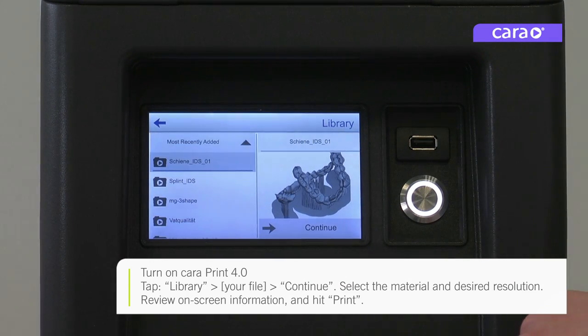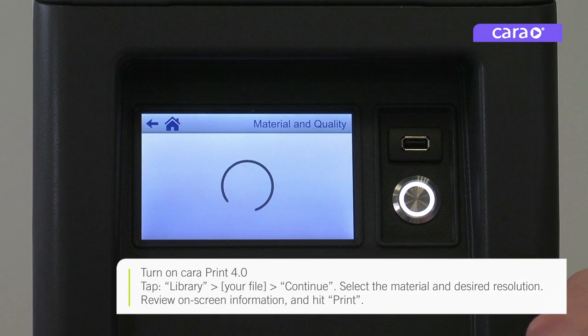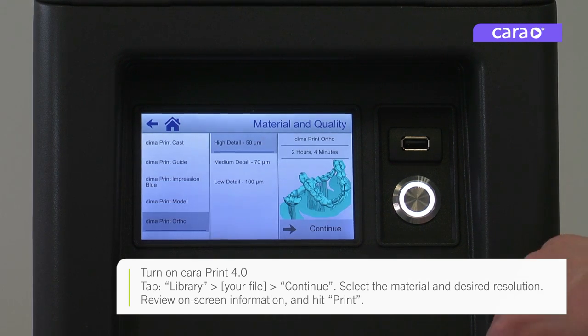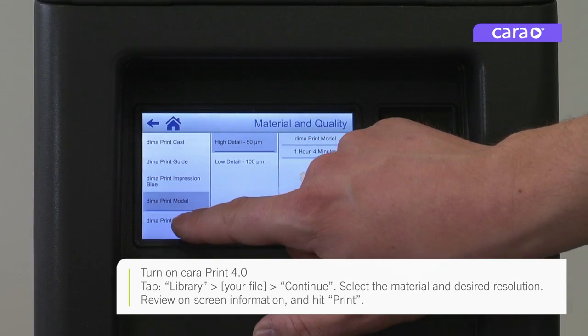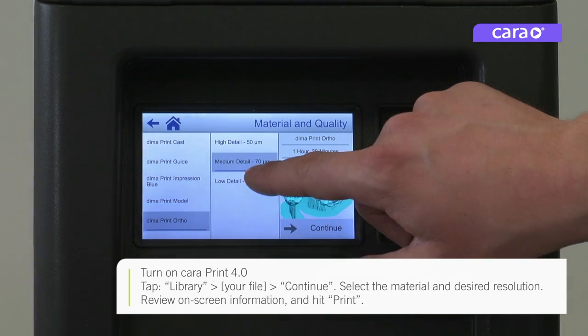Tap library and select your desired print file. Hit continue. Next, select the appropriate material and the desired resolution. Check the details on the screen and hit print.